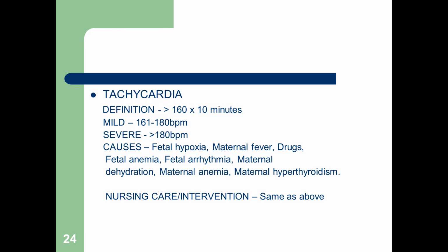Now, let me just say this. If the mama's running a fever, chances are the baby is. And we couldn't check the baby's temperature, but we can know this by their elevated heart rate. That's a response to the mom's fever. So if you have a patient who is running a fever, you would anticipate that the fetal heart rate would be high.